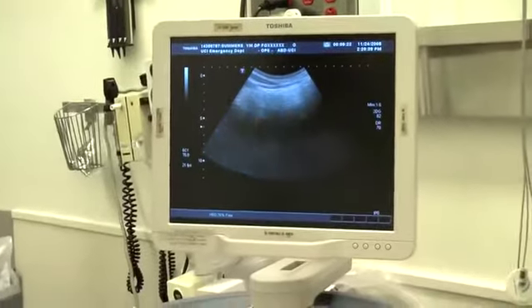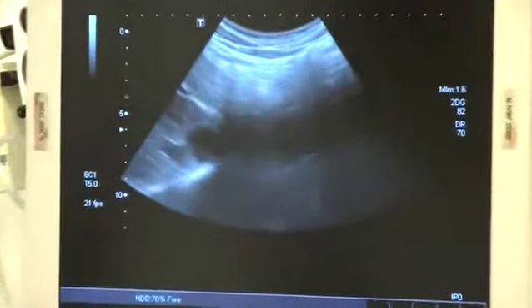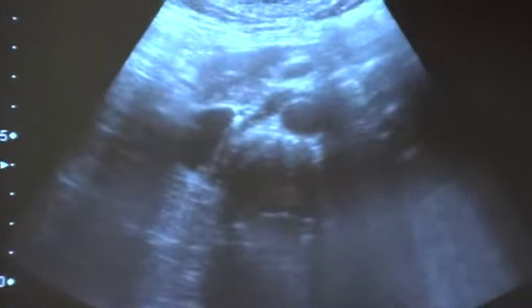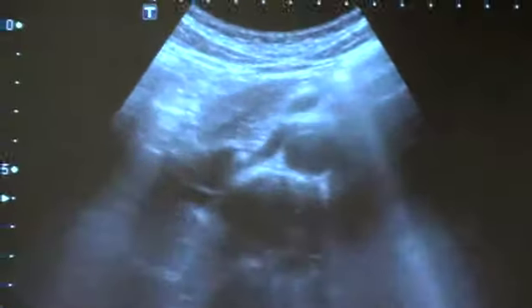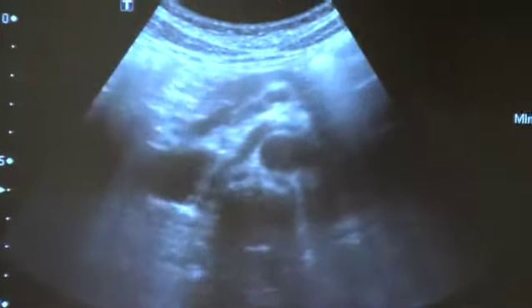As we come into our first view, what we'd like to acquire on the screen is an image of the spine shadow. This should be what your eye gravitates toward, your home base as you acquire this image. The spine shadow is going to be a curvilinear, hyperechoic shape, casting, as the name implies, a shadow distally. As with all things here in California, we concentrate on real estate and sunglasses. Our real estate right now is a little bit wasted, so we do want to drop our depth down in this non-McDonald's indulging patient. We're going to maximize our picture just a little bit.